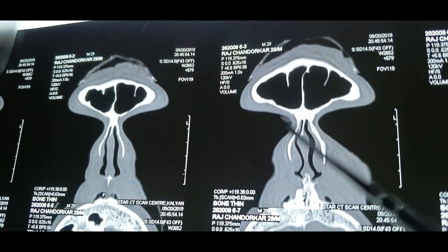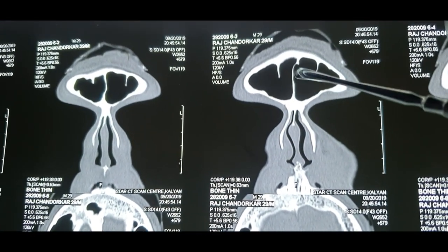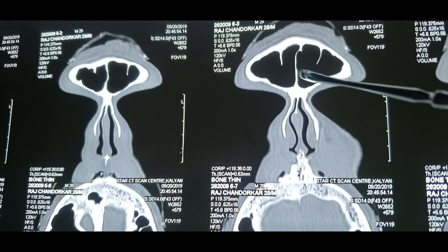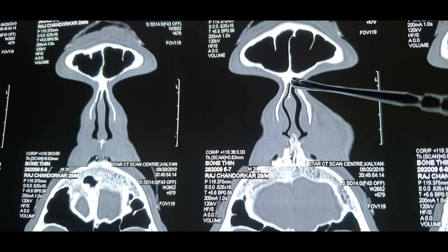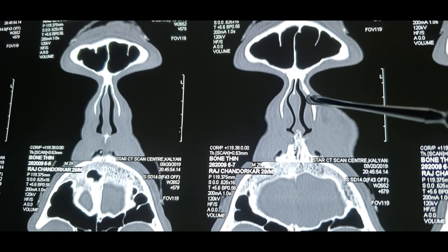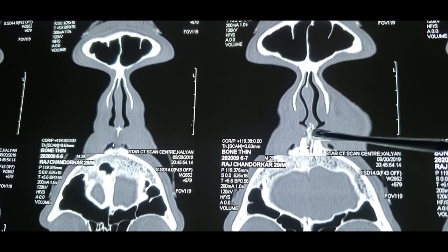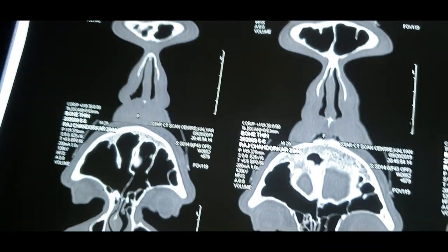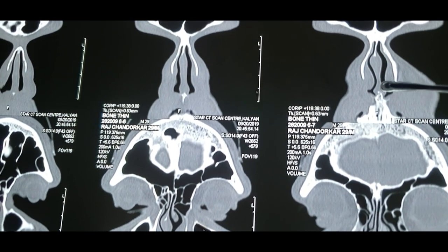if you are moving posteriorly, see, as compared to the second scan, the third scan is showing even bigger frontal sinuses. So these two frontal sinuses are even bigger. So as you're going posteriorly, the frontal sinus size increases. You can see the nasal bone area here in between, the frontal beak area. This is a perpendicular plate of ethmoid becoming even more prominent. The frontonasal process of the maxillary bone. This is the nasal septal cartilage. This is an even more prominent nasal spine. This is not the nasal spine anymore because it was most anteriorly. This is the area of the maxillary crest attached to the cartilaginous part of the septum over here.